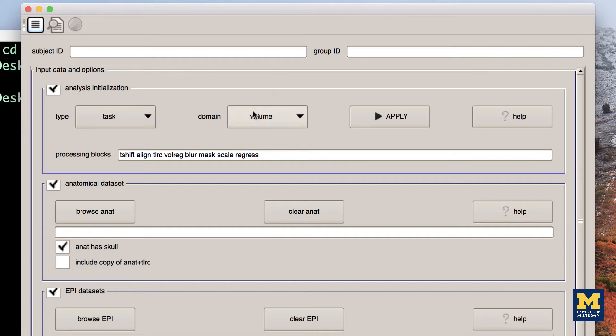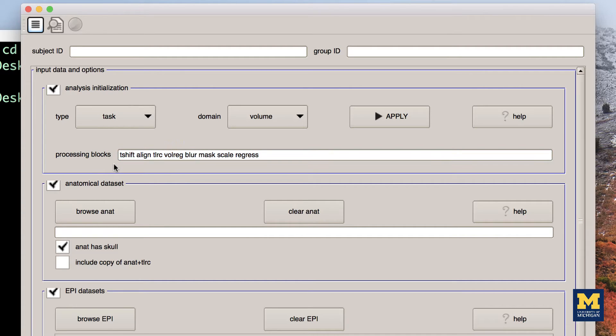The words in the field after Processing Blocks, T-Shift, Align, Tirek, Volreg, and so on, probably don't make sense to you right now. Our goal is to learn about what each of these words mean, what preprocessing step they correspond to, and why we do them.